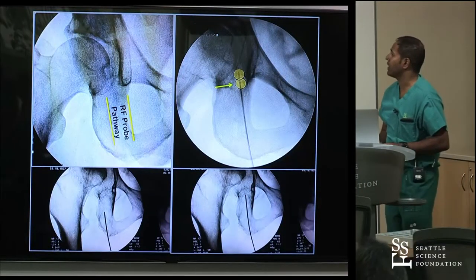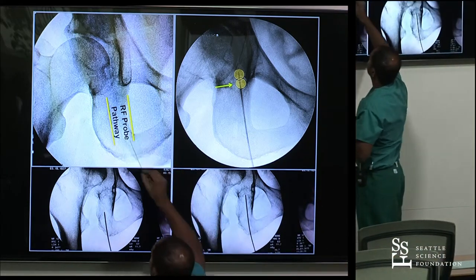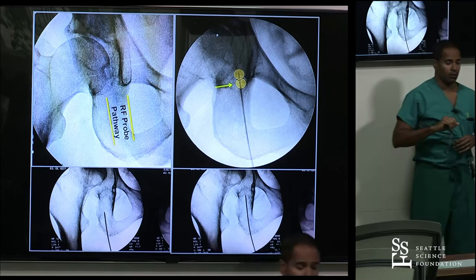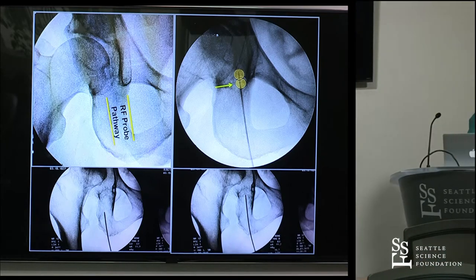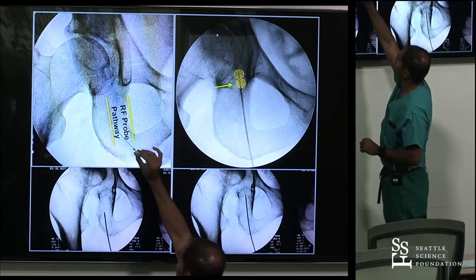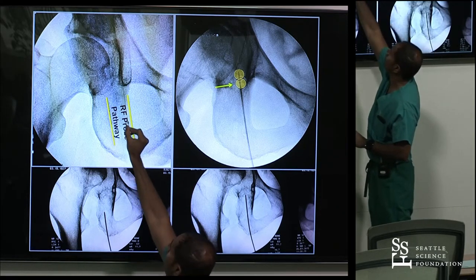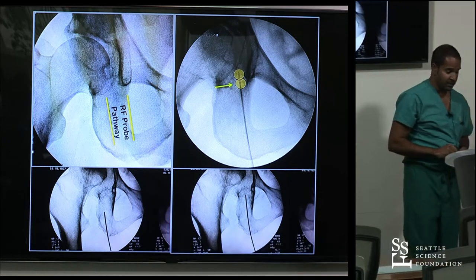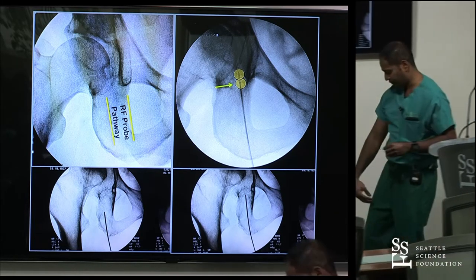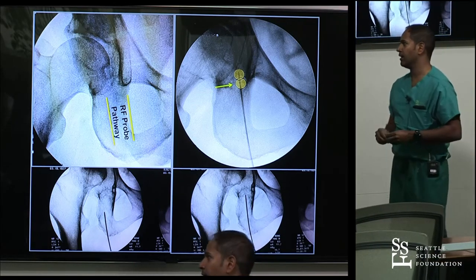Your runway is right along the yellow-marked path next to the incisura. Walk right onto the os. Many patients referred to me had BMIs well over 30, so you wouldn't know your depth until you touch os. Touch os, the patient will jump or scream a little, inject local, come back shallow, and then start working superiorly. Warn patients this is a disconcerting procedure — a needle is basically entering their pelvis from the proximal thigh.